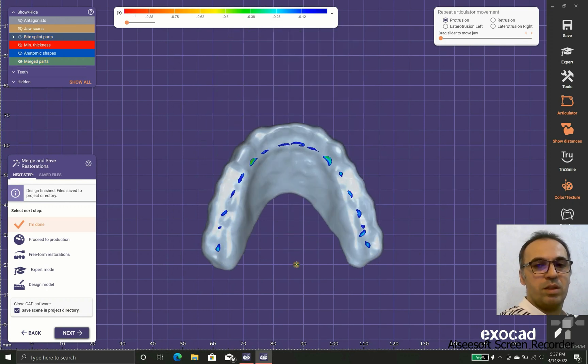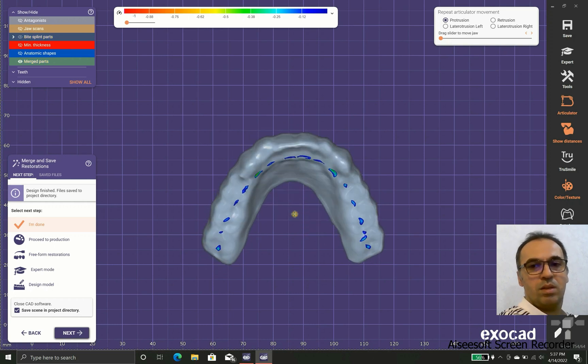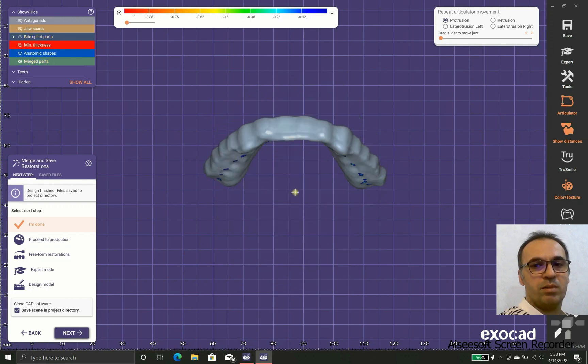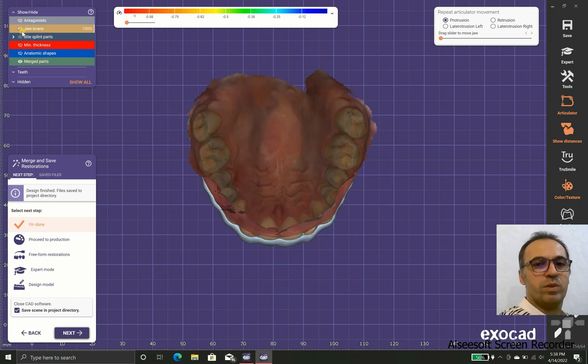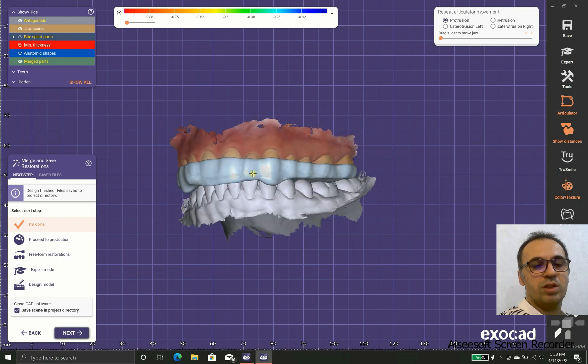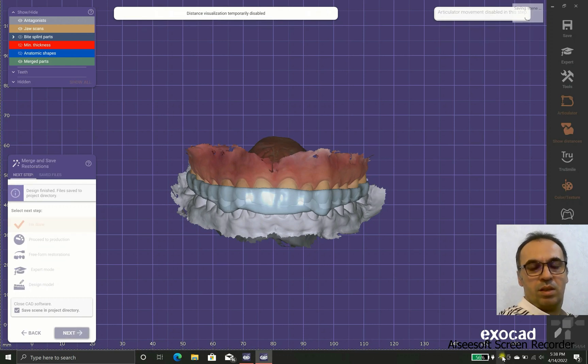Everything is in good position for the final check. We have the canine ramp, we have the posterior area flattened, it fits well with the upper jaw and the lower jaw, and it is ready to be 3D printed. Thank you everyone, have a nice day and I hope you enjoyed this.